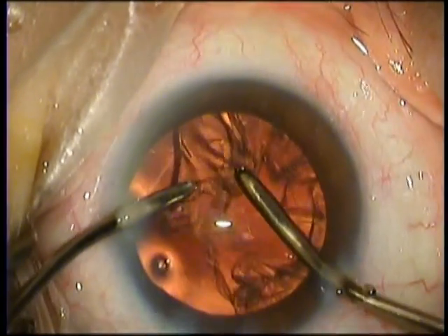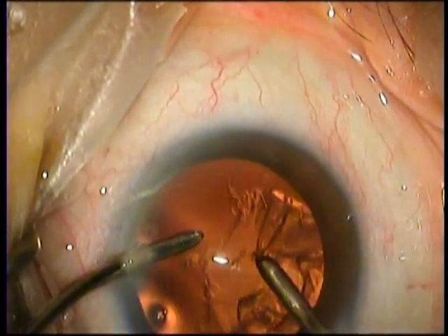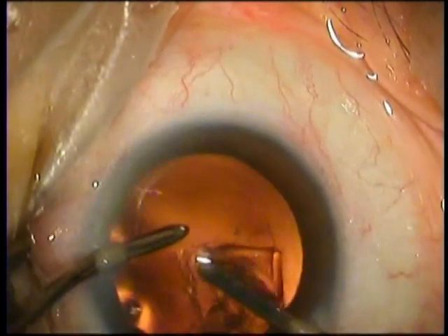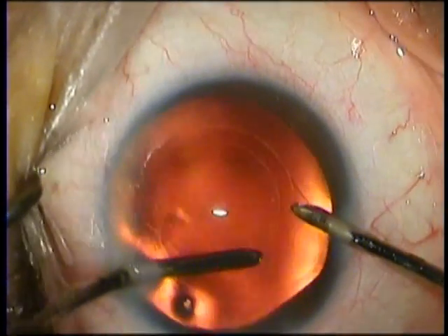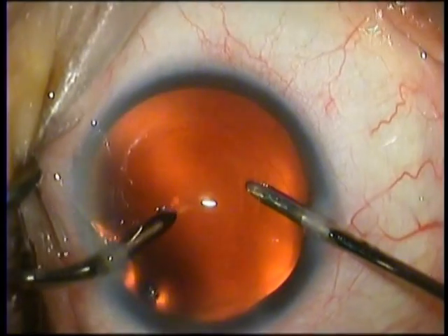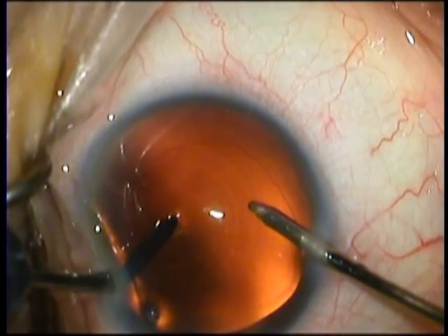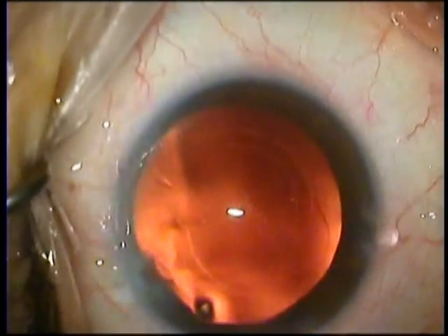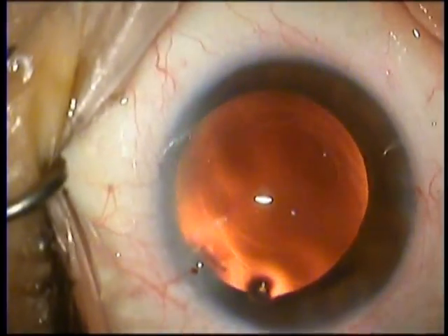Aspirating the cortex now is an easy job with the bimanual I and A. If you notice, there is a small plaque of cortex sitting right at the bottom of the bag. And using the capsule polish mode on the console, we gently aspirate this cortex into the pot. We are wary and fully aware that that last bit of cortex might have a nasty surprise behind it in the form of a weak capsule. So one takes it very gentle at that stage.